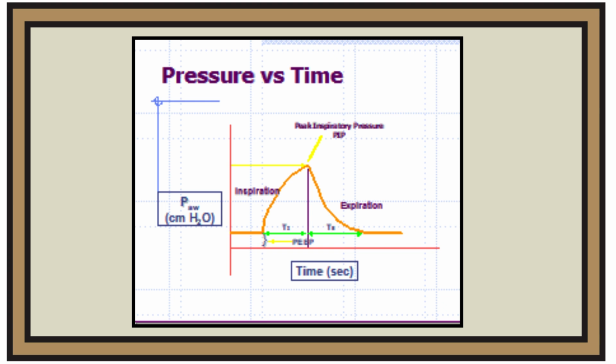Peak inspiratory pressure is the maximum pressure achieved during the breath. Peak inspiratory pressure indicates the pressure required to deliver a set tidal volume during volume ventilation. Increased airway resistance or decreased lung compliance results in an increase in the PIP. PEEP is confirmed only with a pressure versus time scalar and the pressure volume loop. PEEP is present when the baseline pressure is above zero.